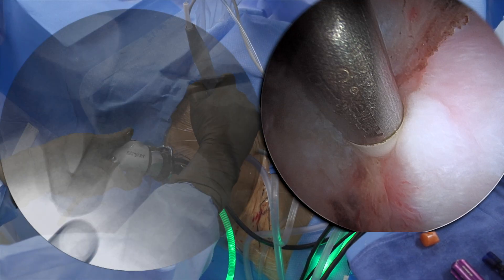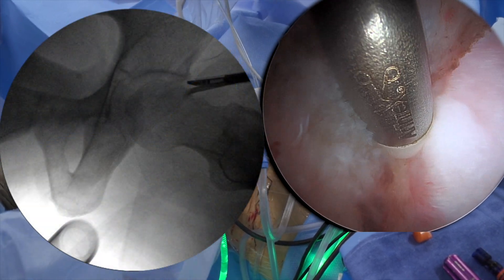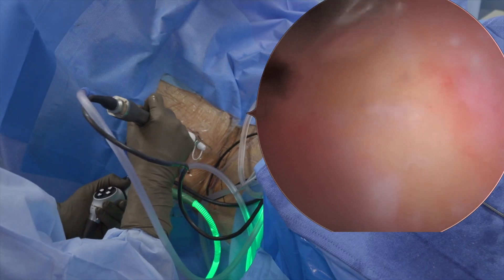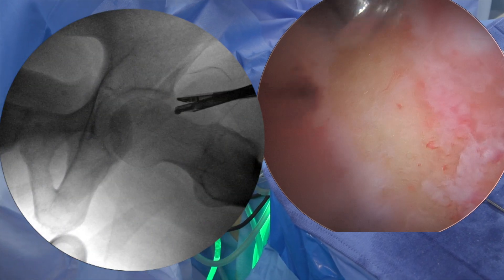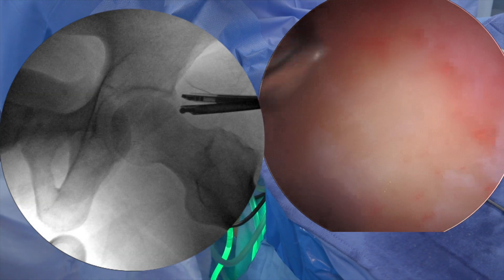Traction was released and the peripheral compartment was inspected. Femoral neck osteochondroplasty was performed with the burr using fluoroscopy to ensure adequate cam resection was performed.